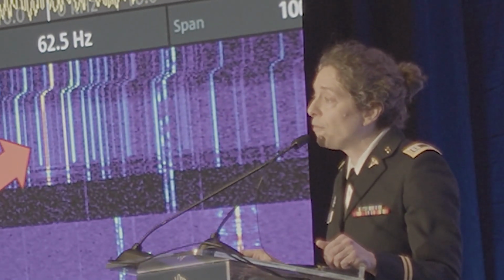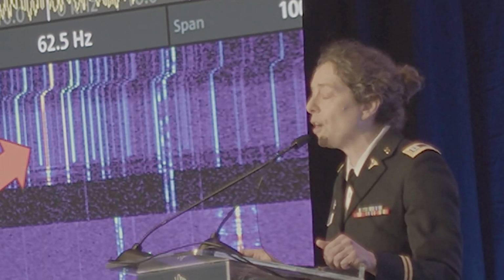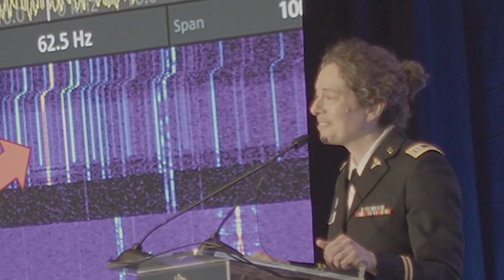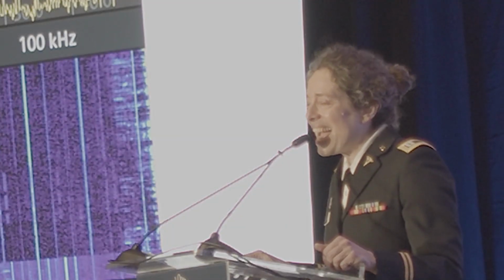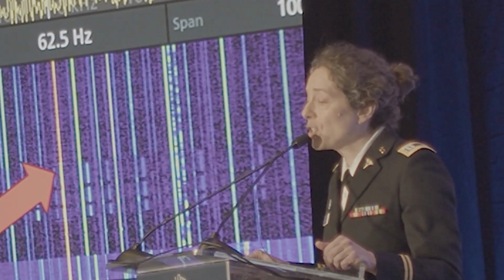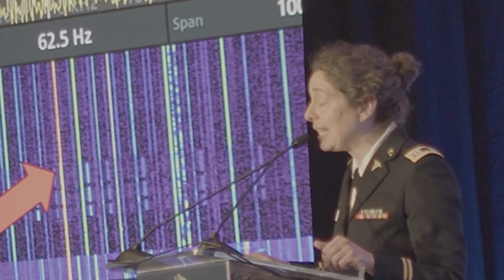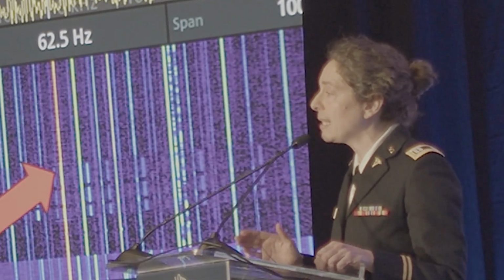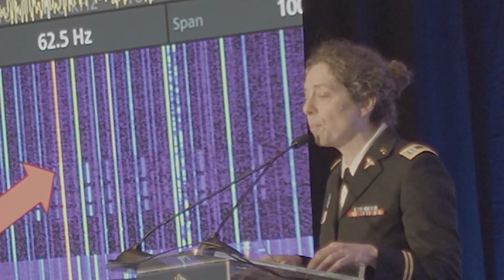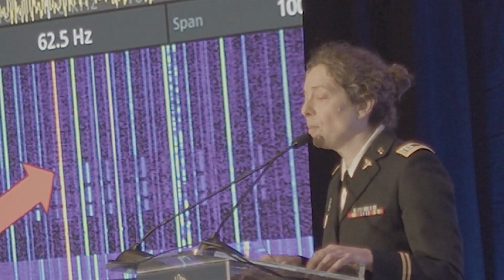The Philips Lumify linear probe had an electromagnetic signature detected at negative 118 decibel milliwatts. And the Philips Lumify phased array probe had an electromagnetic signature detected at negative 115 decibel milliwatts. Now, these two signatures are the largest signatures that we measured for our ultrasound probes, and they are below negative 110 decibel milliwatts.